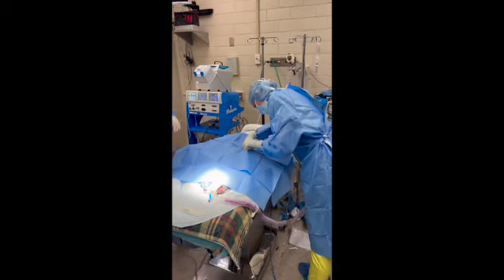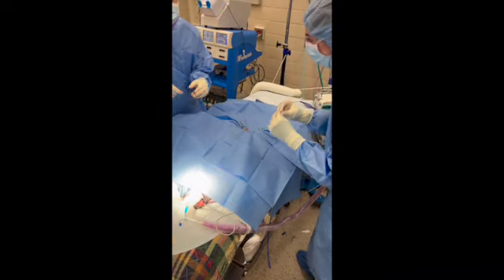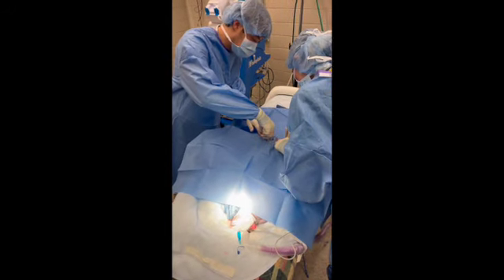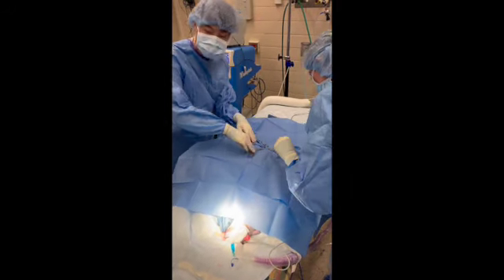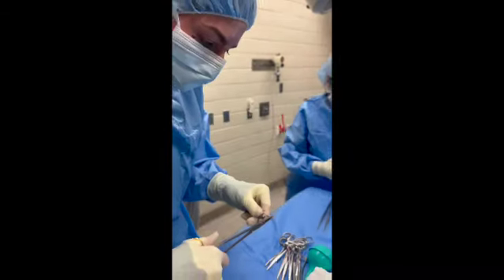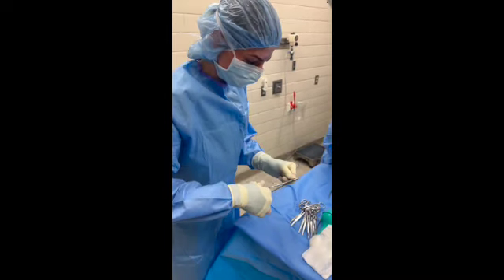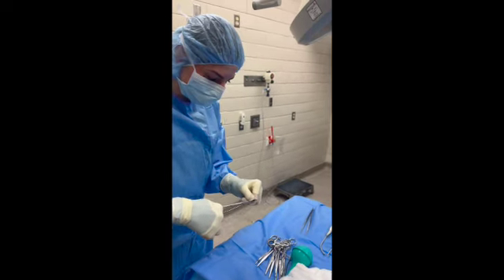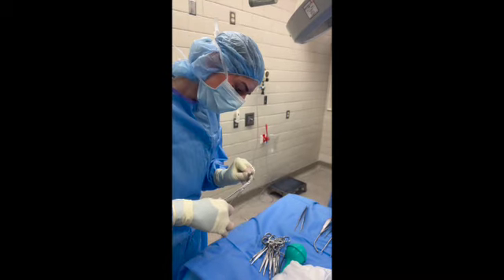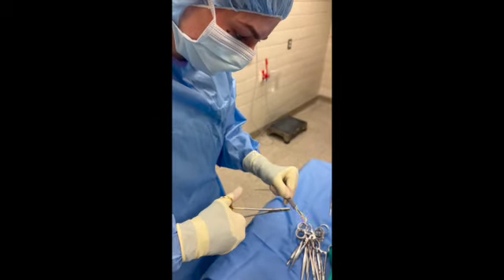How many do you have to do? Just one? Just one. You can take your time because we don't need that blade. Okay, post-op is getting ready. ICU fluid order request is not needed. It's done. Awesome. Has anesthesia's antibiotic been given? Yes, Cefazolin is given, 77 milligrams at 10:45.